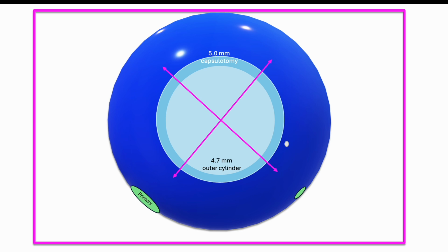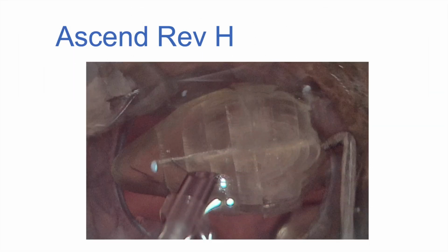We can also see that since I have the horizontal cut overlapping by 22 microns, it actually allows gas bubbles to collect outside of the plug area. And I watch for this so I can then stick a second instrument in those gas areas to allow leverage.